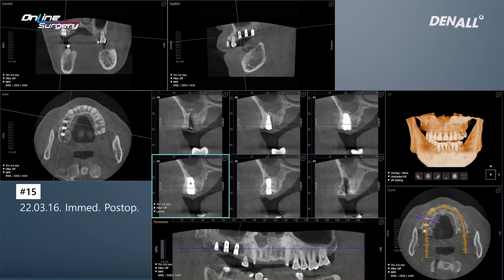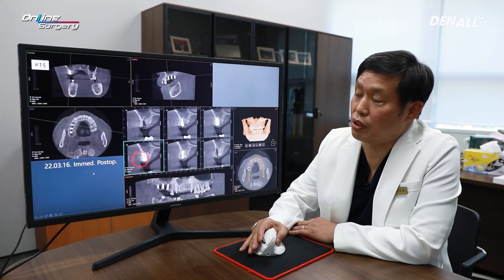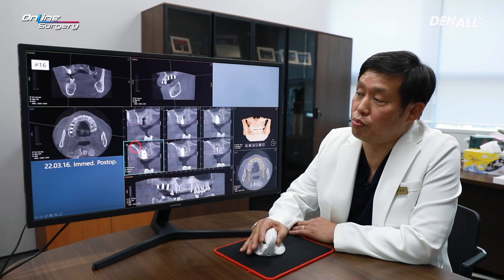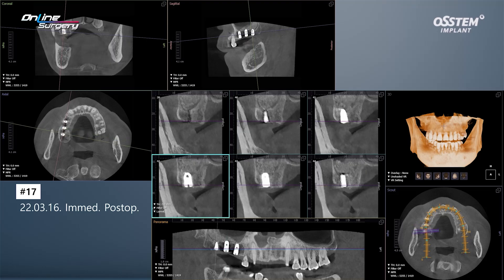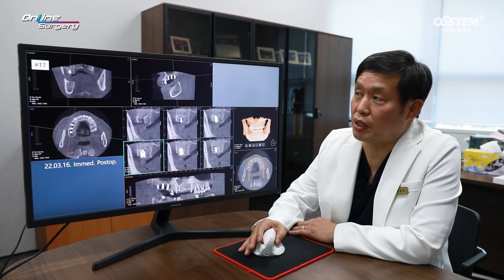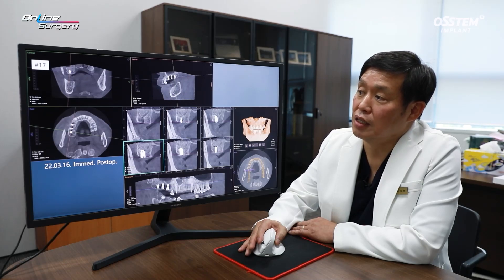On the post-op CT, for number 15, the exostosis area on the buccal side was removed using a chisel as planned. If it were not removed, it could have been a problem during prosthesis. The implant position looks okay. The window seems to have been made a little bit lower than expected. There is no problem related to bleeding. For number 17, the bone graft was positioned more posteriorly than expected due to the smaller Last kit window.